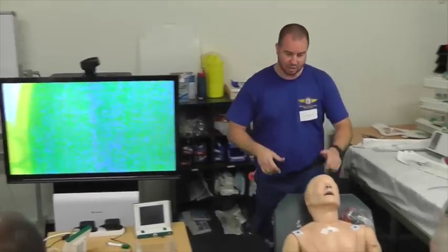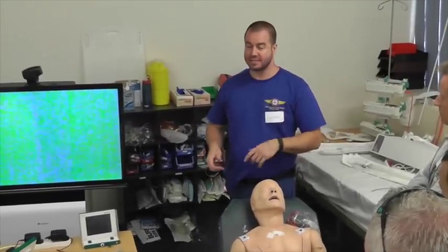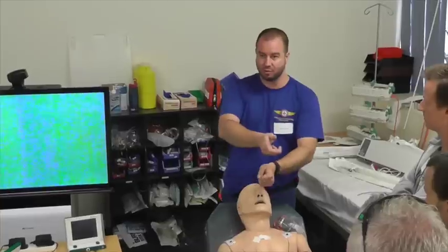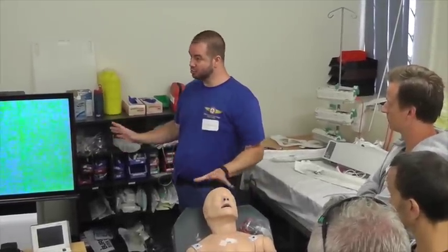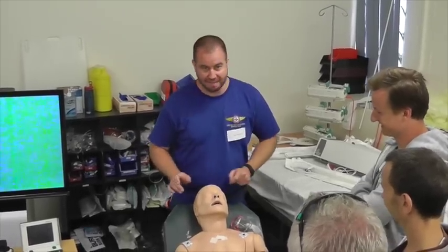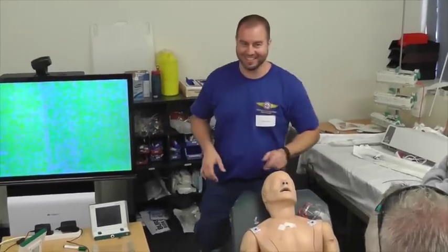The ENT guys do all this stuff for the vocal cords, to have a look at vocal cord anatomy and pathology during nasal endoscopy. I do that just for my own amusement. Okay? You do it on the patient.